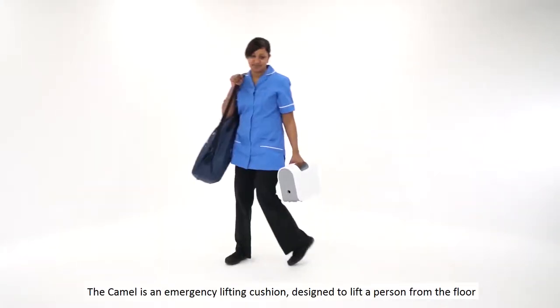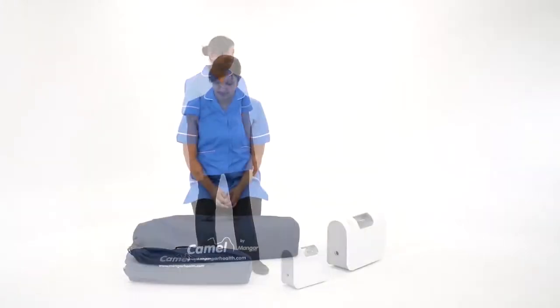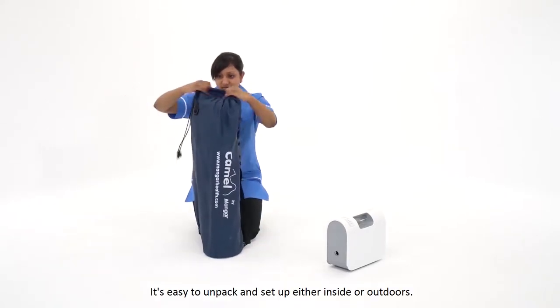The Camel is an emergency lifting cushion designed to lift a person from the floor with the help of one caregiver. It's easy to unpack and set up either inside or outdoors.